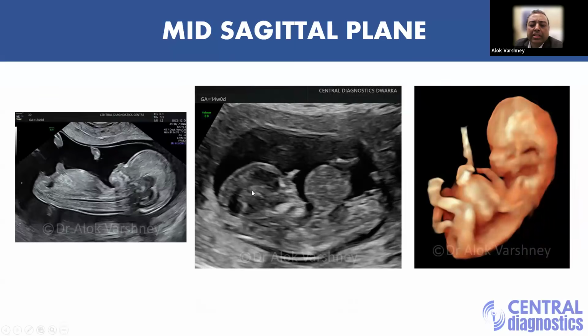And this one, as soon as I'm taking the CRL plane, I see something protruding out in the region of the umbilicus, and this one contained the liver, the bowel, and the stomach as well. We see there is insertion of the cord on the top of this mass. So we know this is a large omphalocele.